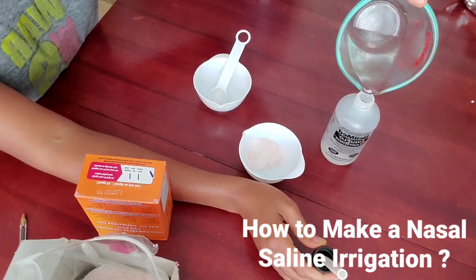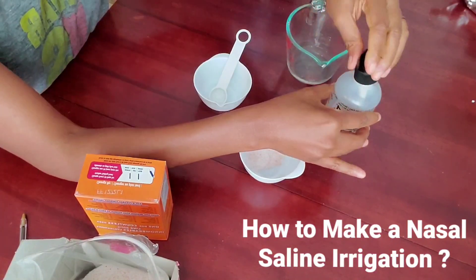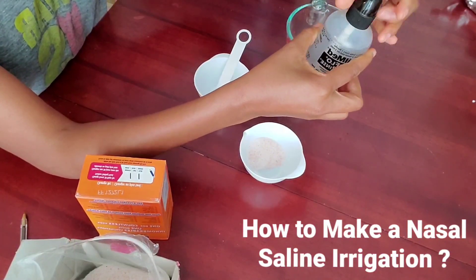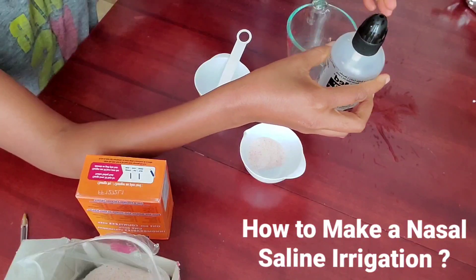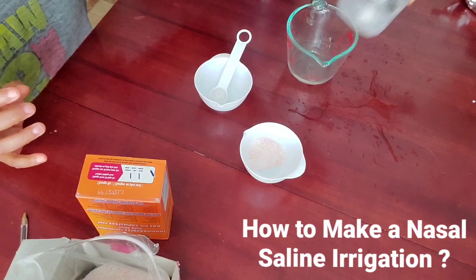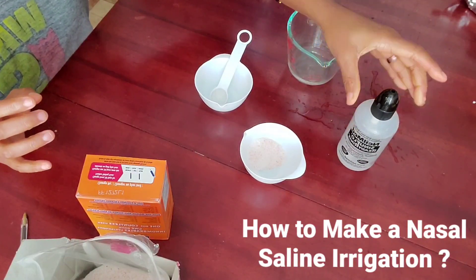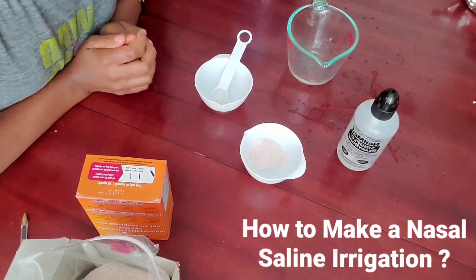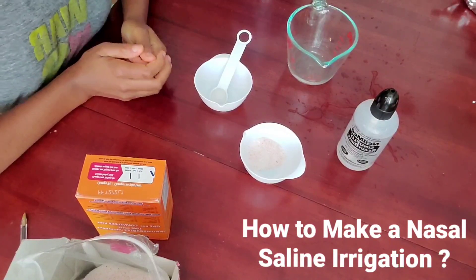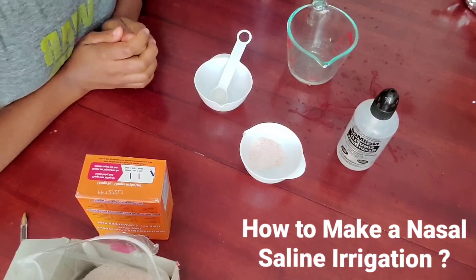Eight ounces. After any small spills, just mix it again. Then you're going to irrigate each nostril. You may repeat as needed, and remember to gently blow your nose after, because you want to get rid of any particles or organisms that could get stuck in the nasal cavity.